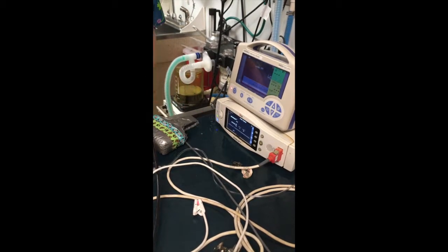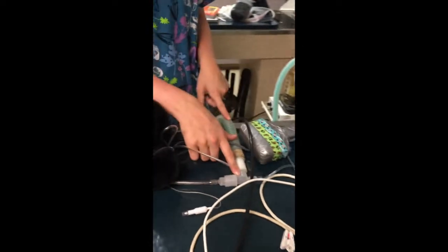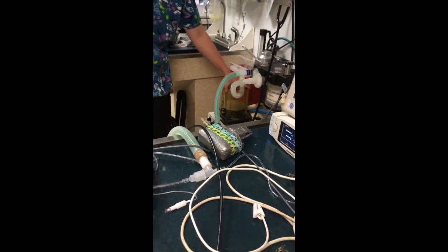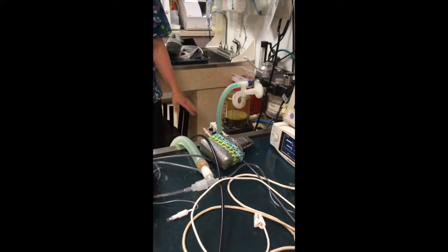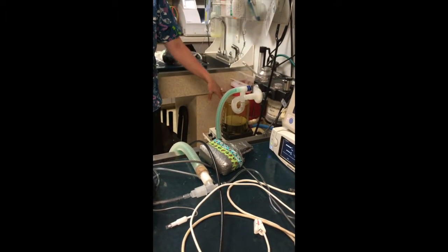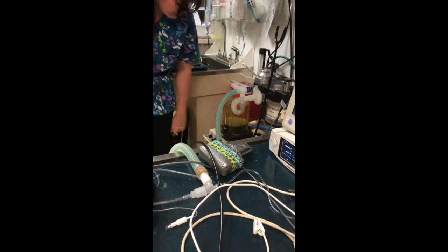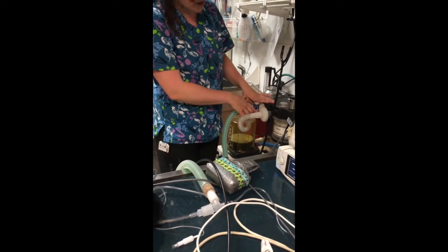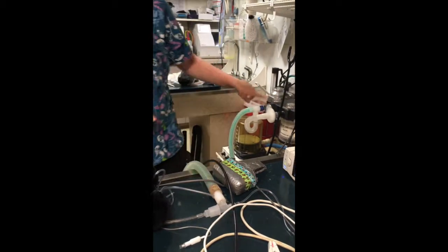So then we have our tube that's hooked to our respiratory monitor. So we have this hooked to our ventilator. When we have them hooked to a ventilator for dogs, we like to have them at 10 breaths per minute. And for the pressure, we want to make sure the pressure is between 15 and 18 centimeters of water.